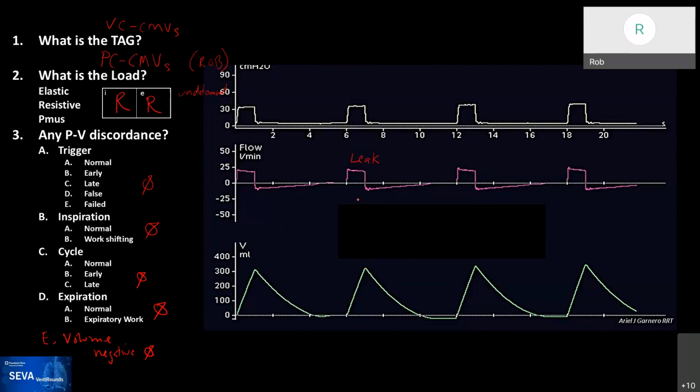So let me ask you a question. Why is the exhaled volume larger than the volume inhaled? I'm not sure about that, but you have inhaled and exhaled volume because the RC part is doing that. The RC part? What do you mean by the RC part?